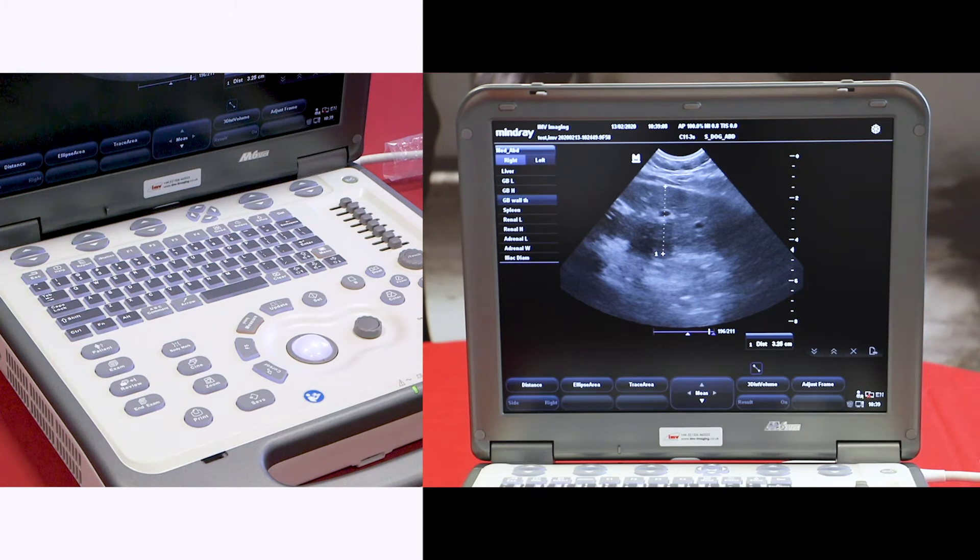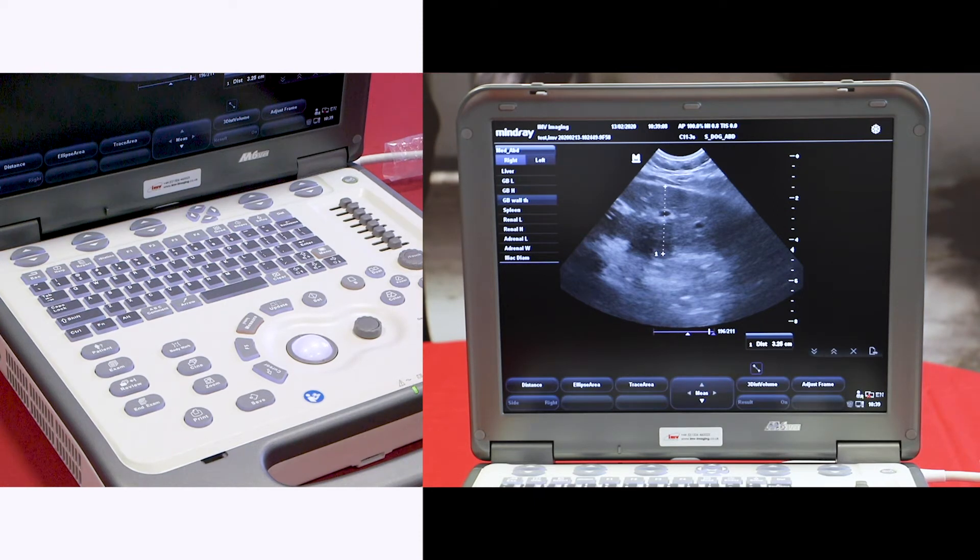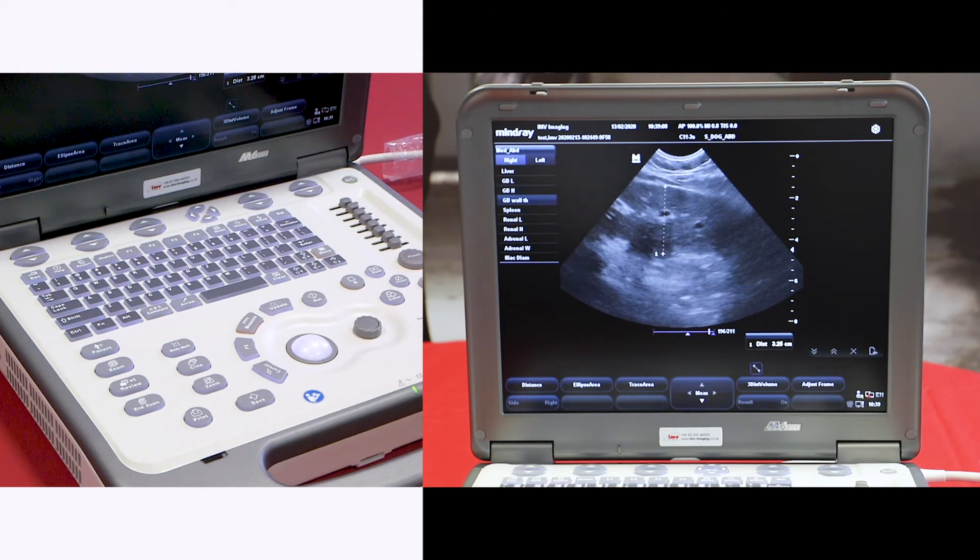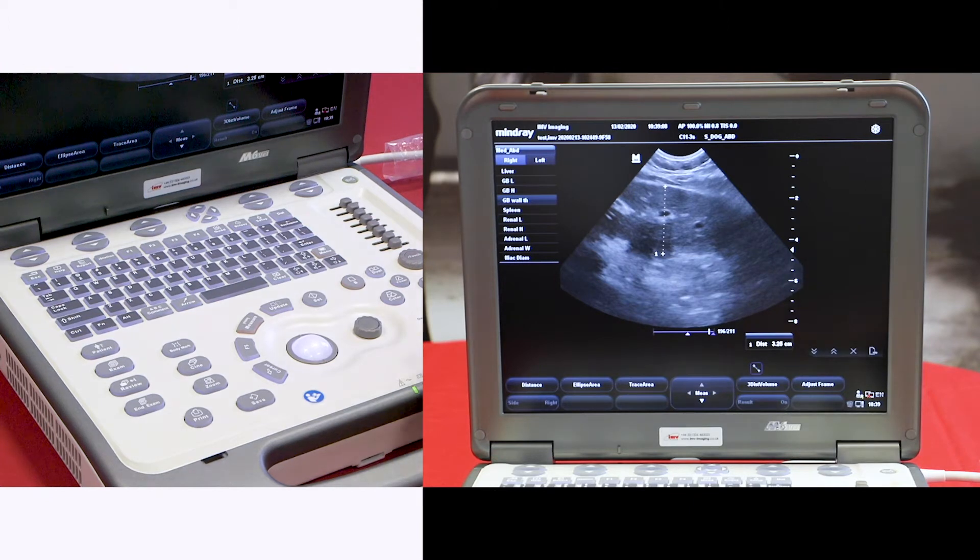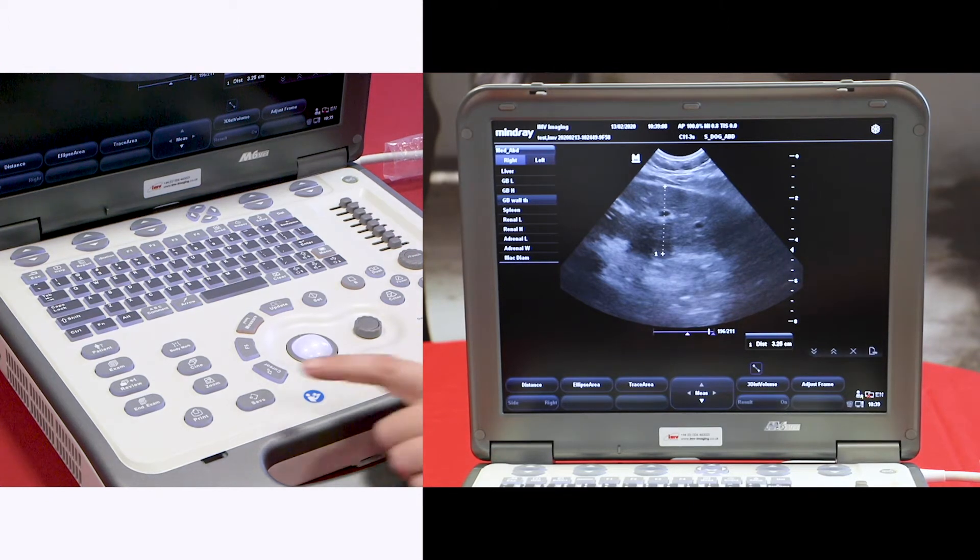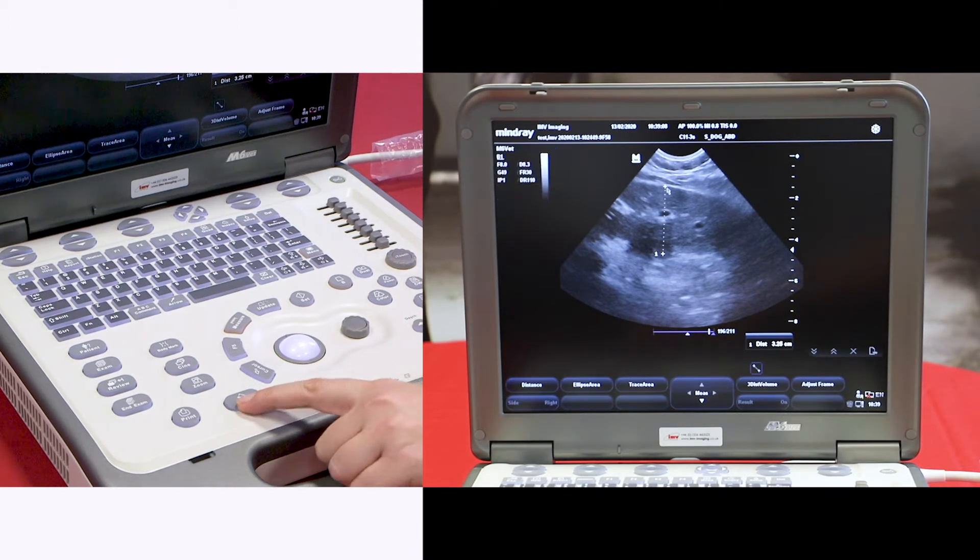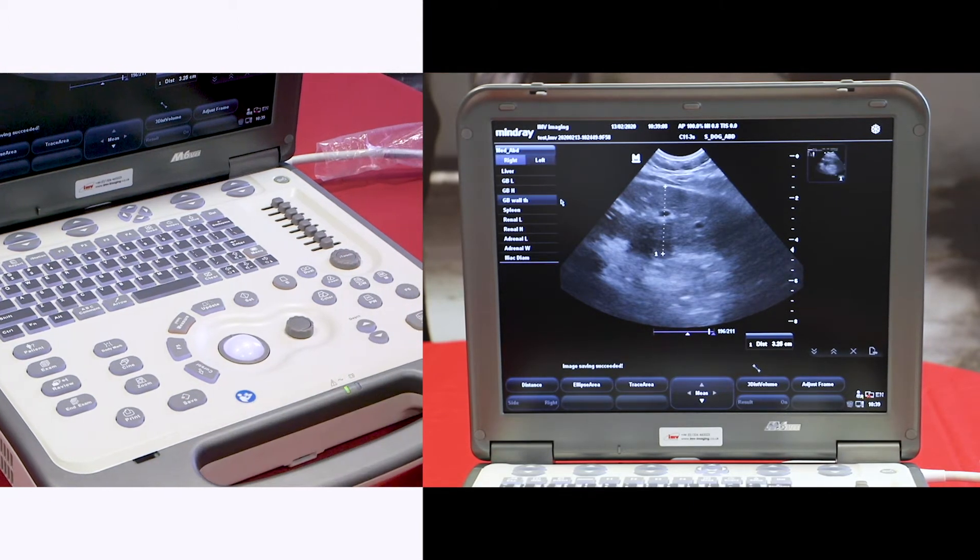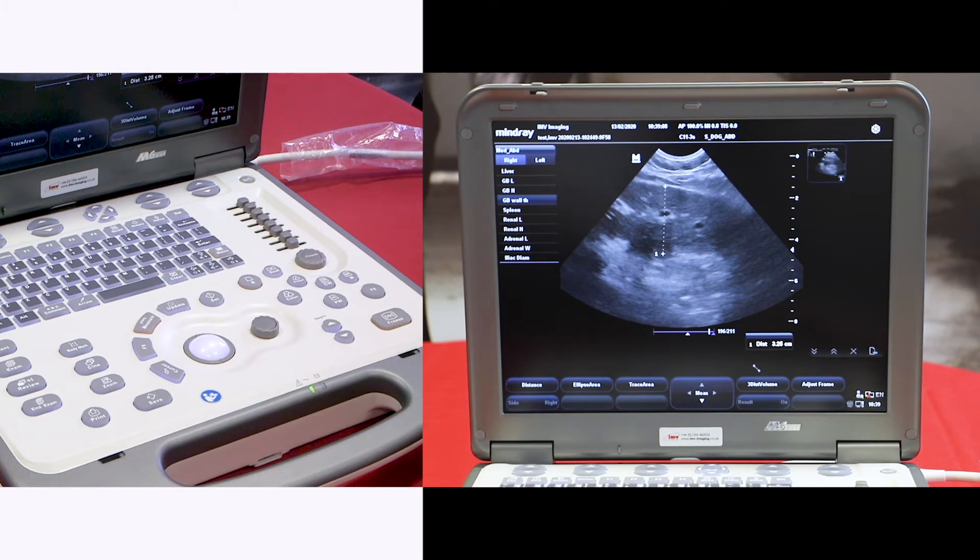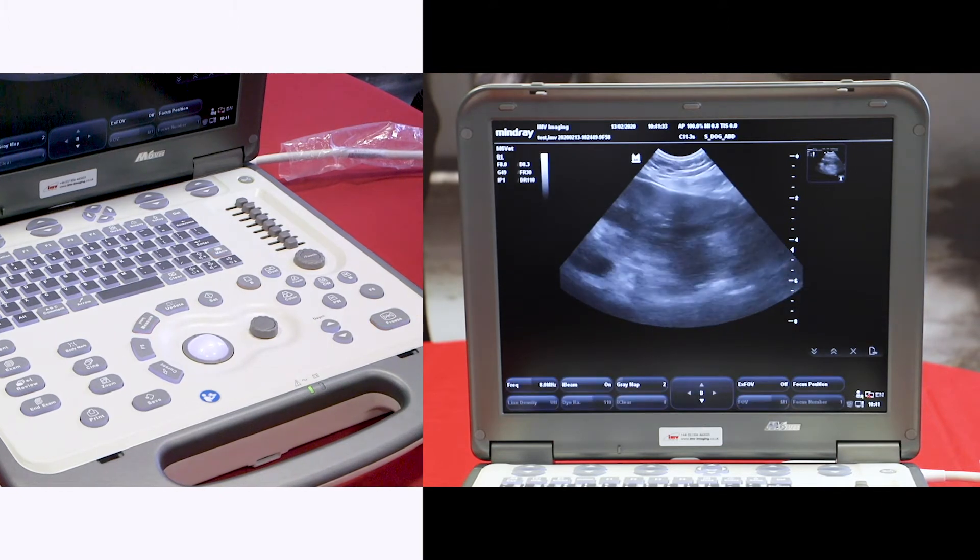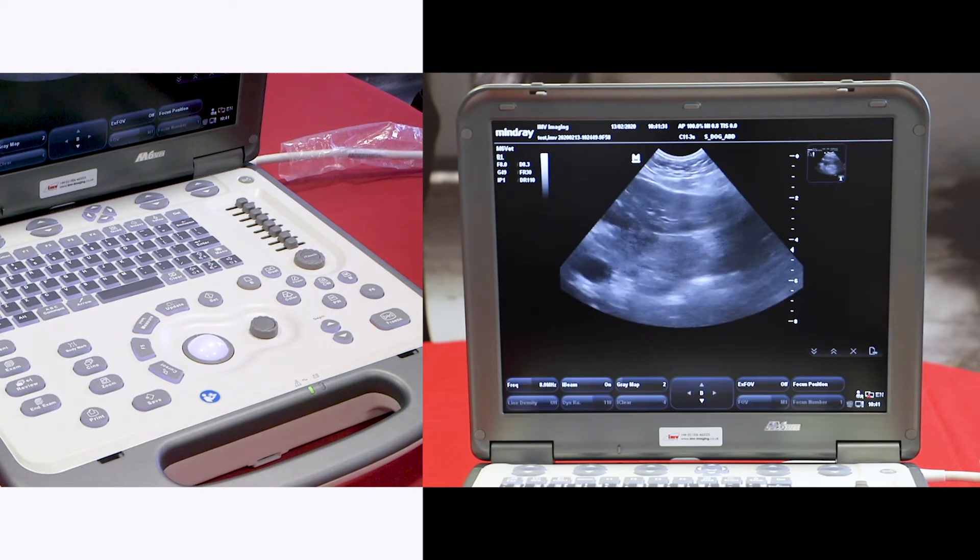If you would like to save this image, just press the save button.